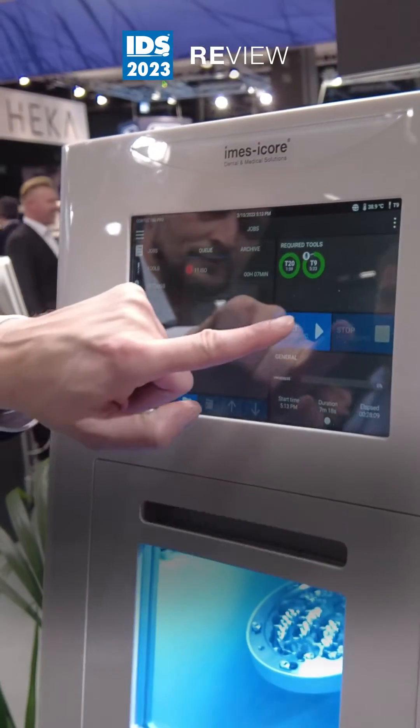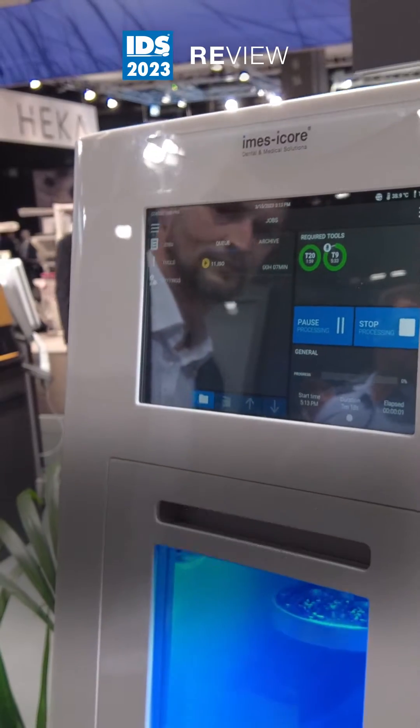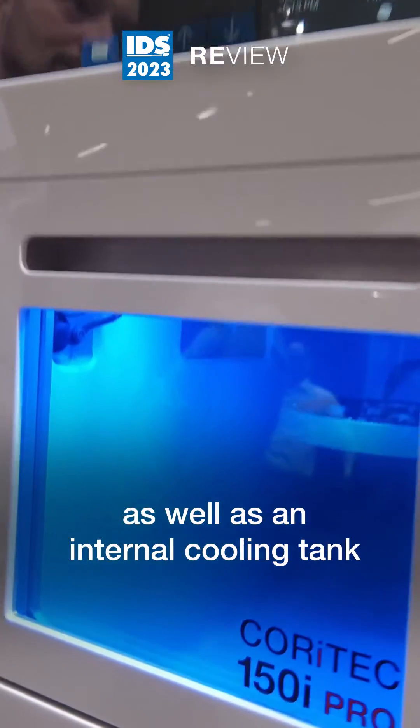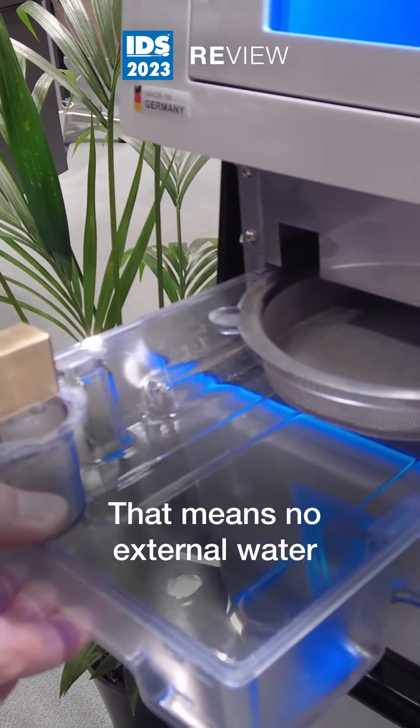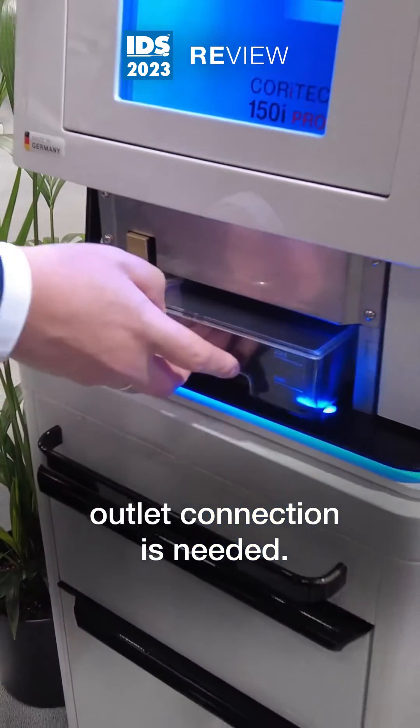This stand-alone machine has an integrated PC and touchscreen, as well as an internal cooling tank with filtering system. That means no external water outlet or connection is needed.